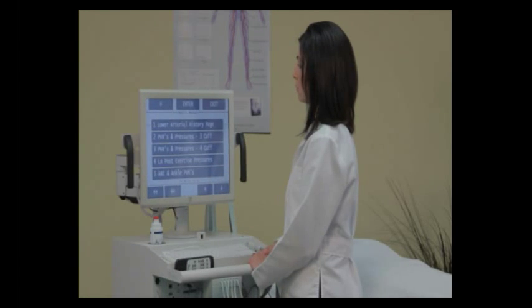menu screen. The screen that you see here in this video is not necessarily the setup that you will have on your multi-lab instrument. Each multi-lab can be configured many hundreds of ways. This is just a configuration that we're using today.